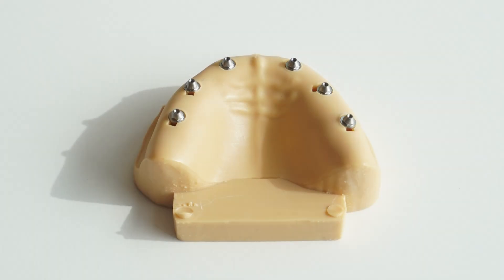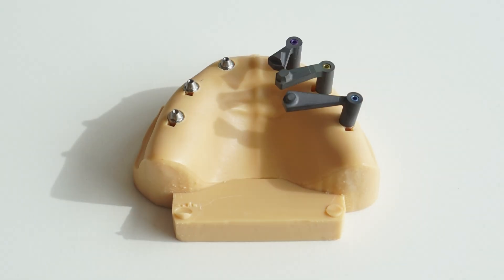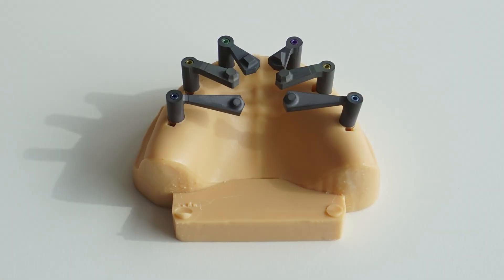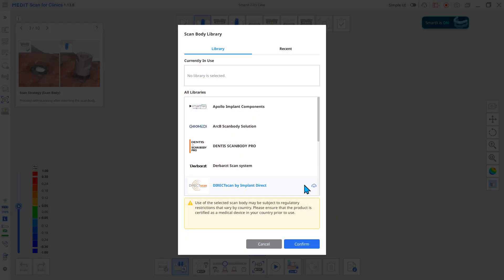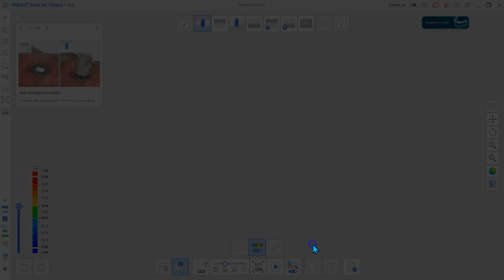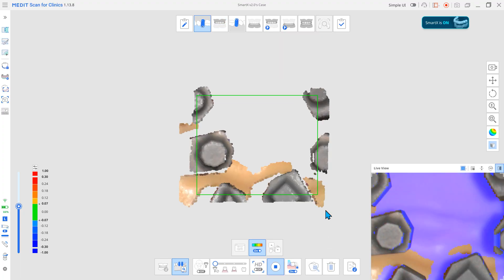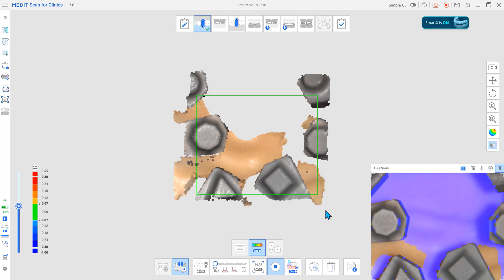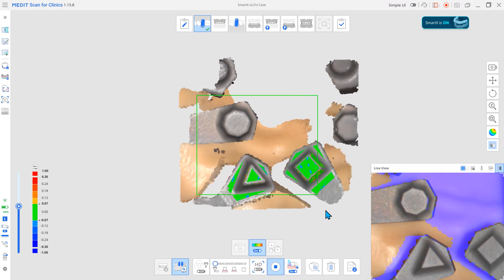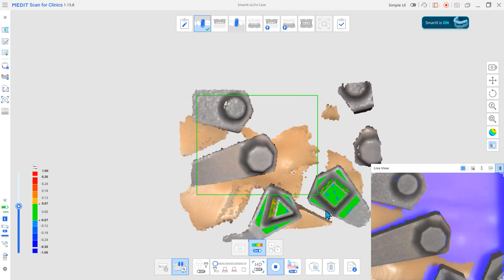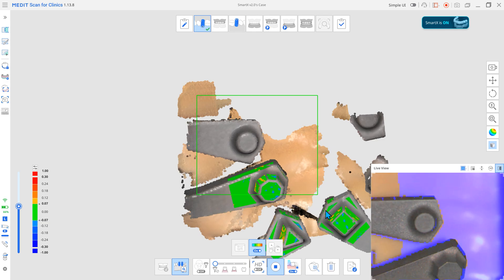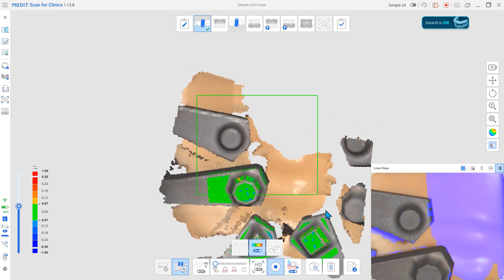First, attach the scan body to the multi-unit abutment, following the manufacturer's instructions. Select a library and scan the matching point of the scan body. By scanning only the required areas as instructed, you can capture a precise implant position.